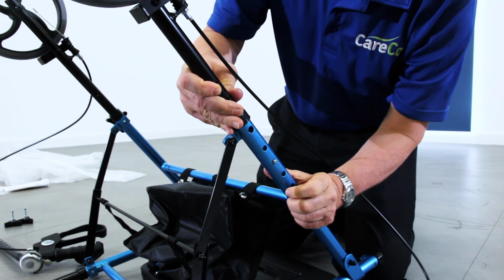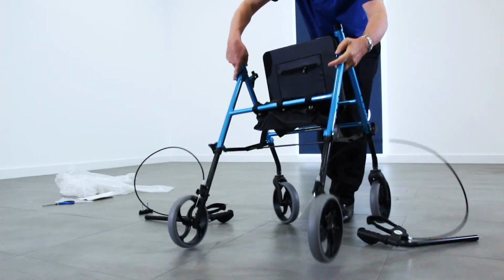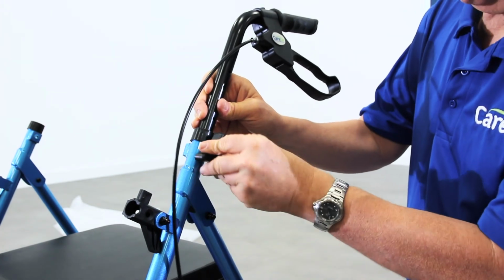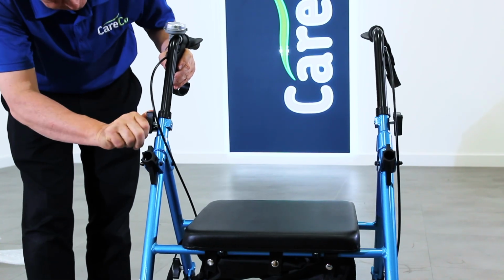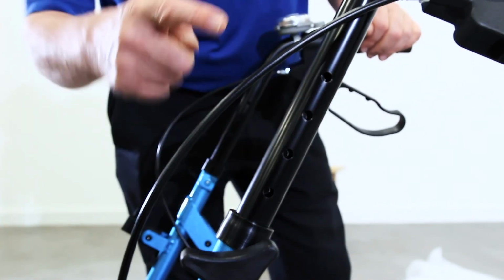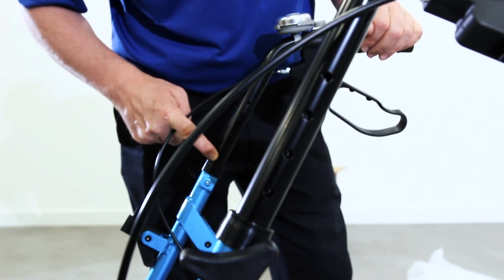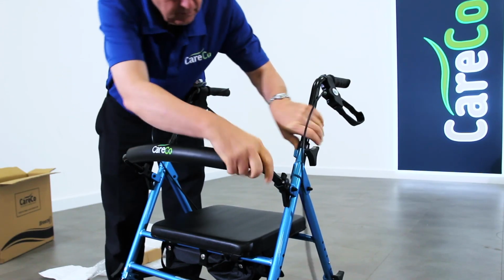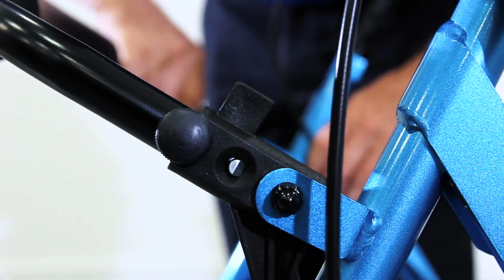With the front wheels in, you can now add the handlebars. Secure the handlebars using the tightening knobs. There are holes on the side that allow for a variety of handle heights. Make sure the handlebars line up for better comfort when walking with the rollator. Finally, attach the folding backrest, which can be easily clipped into the frame.